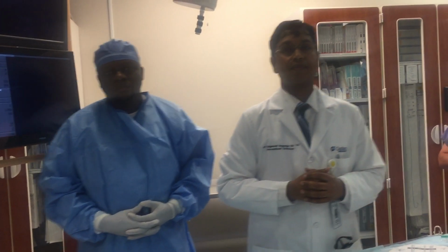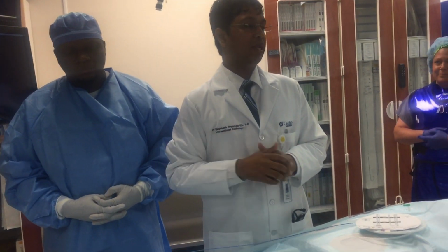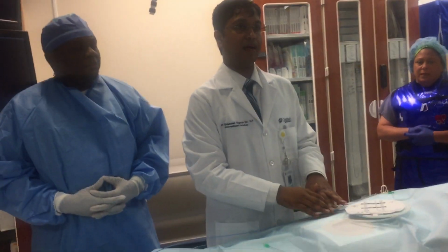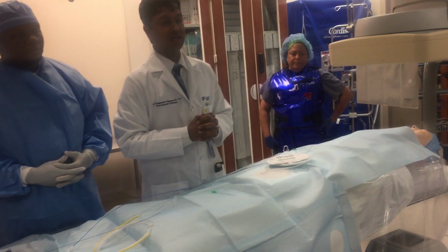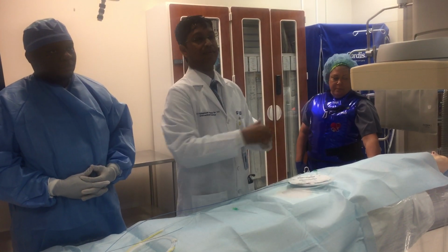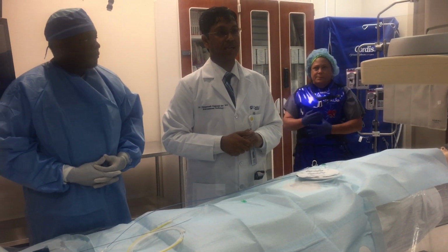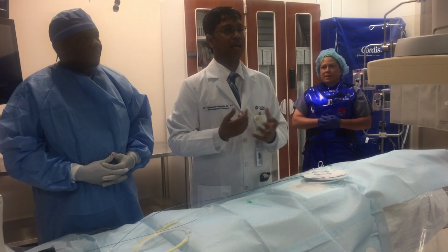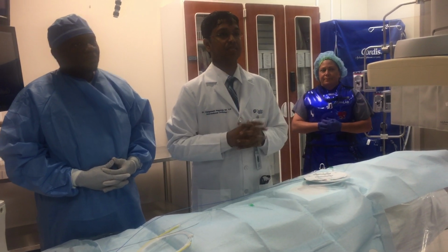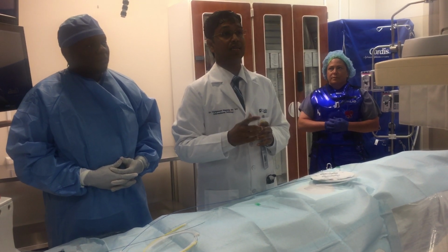And what do we do after placing a stent? After we place a stent, we close the groin. We have modern devices to put a stitch from within. Then we move the patient to a recovery area or a cardiac intensive care unit, where the patient stays overnight. We make sure there are no major cardiac problems, and then they get discharged the next day.